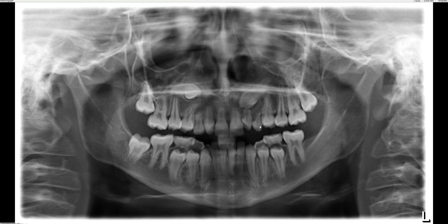There's a primary canine that's just ready to be exfoliated — the root is almost entirely resorbed at this point. Now, number eleven has caused significant resorption of number ten. Number ten has unfortunately lost at least one half of its root — the apical half. At this rate, as the canine continues to try to erupt, it's only going to cause more resorption of number ten. This is a very unfortunate case — it failed to erupt into the correct position and is impacted and malpositioned within the alveolar process.